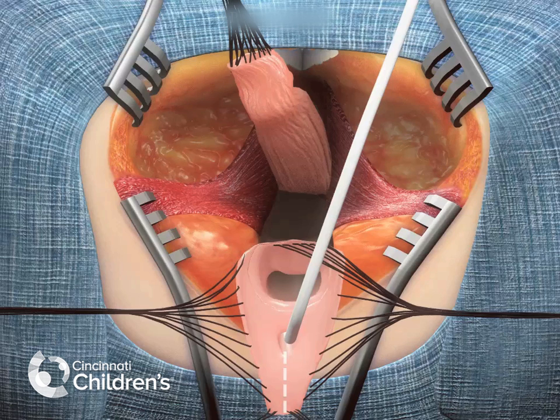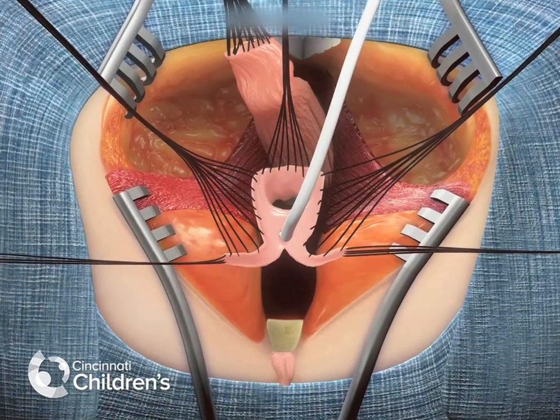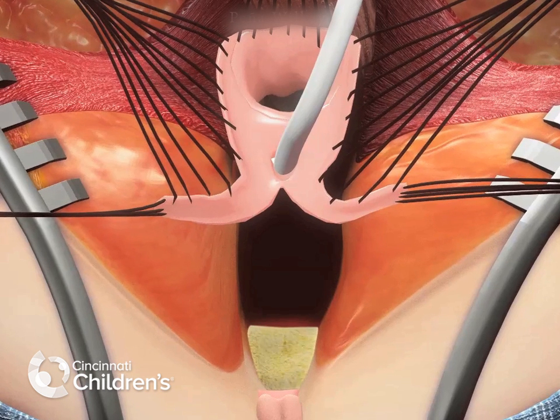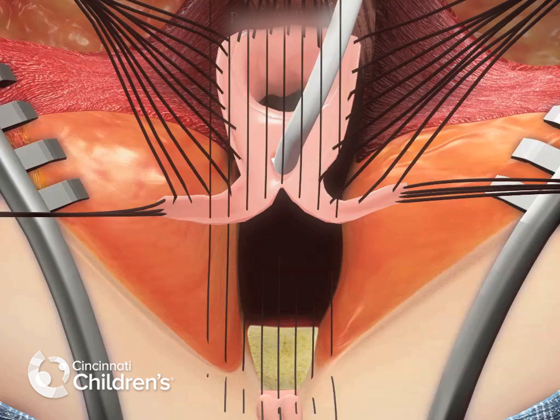At this point, the previous common channel is divided in the midline. The new position of the urethra is established at the mucosal edge that was about 5 mm from the clitoris. Multiple 6.0 Vicryl sutures are used to perform this anastomosis.